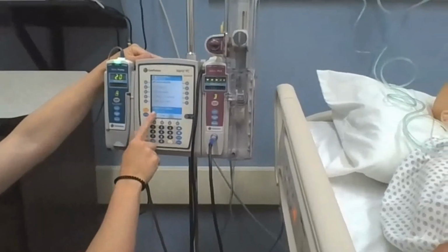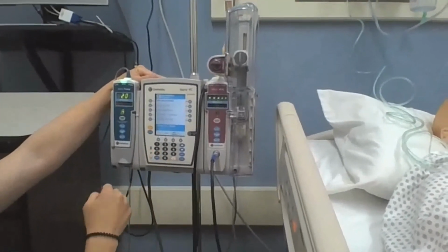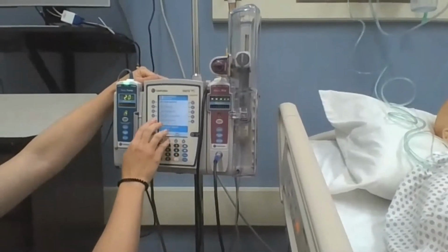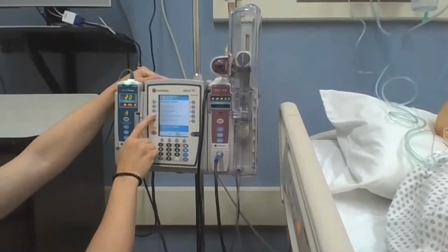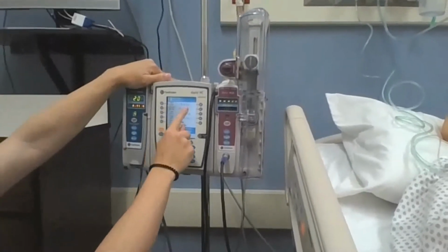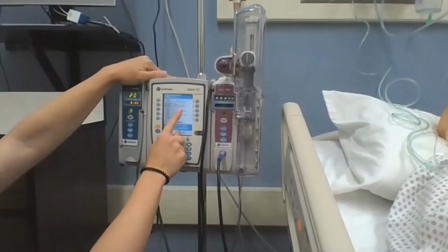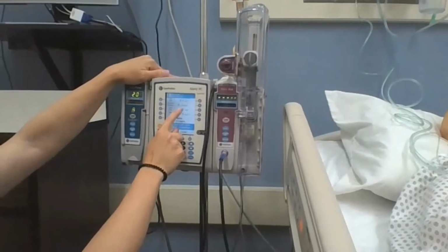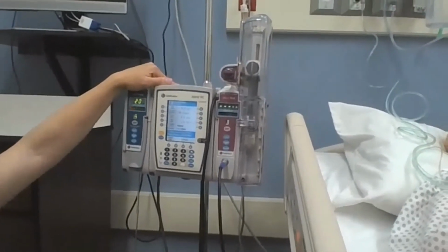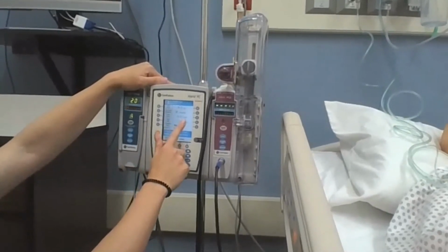Then it's asking for my infusion mode. So we talked about continuous or PCA dose or PCA plus continuous. In this circumstance, we're going to say that the patient, per our orders, is getting a PCA plus continuous. So the PCA dose is 0.2 milligrams with a lockout interval of every 10 minutes. That means that every 10 minutes, if the patient hits the button, they're going to get 0.2 milligrams of Dilaudid. The continuous dose is 0.2 milligrams per hour.